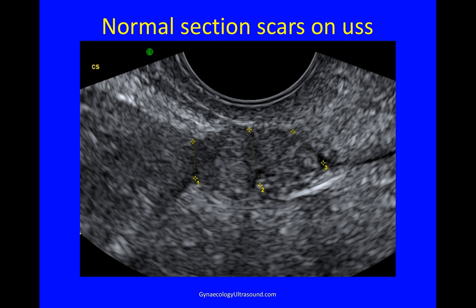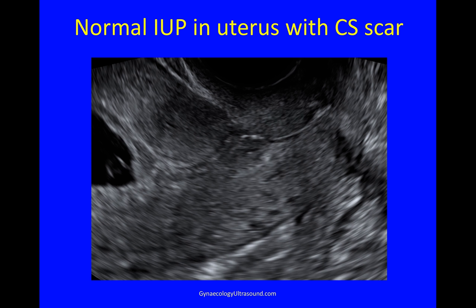Here are some normal caesarean section scars on ultrasound. This is a very magnified view of a longitudinal section through the uterus — here's the cervical canal, and this is more or less the region of the internal os. This is an anteverted uterus; you can see the endometrial cavity here. This patient had had three caesarean sections, all low down as you can see, and the bladder would be up here. In the second image, again the cervical canal and anteverted uterus: here you can see the section scar, then a little bit of closed endometrial cavity, and then the intrauterine pregnancy — you can see it's a long way away from the caesarean scar.